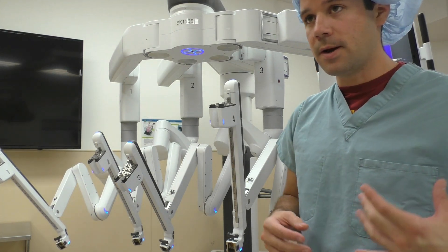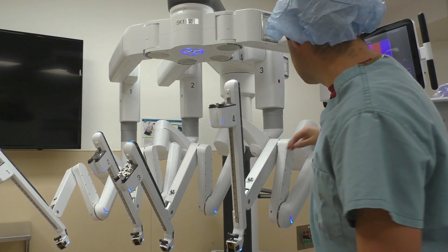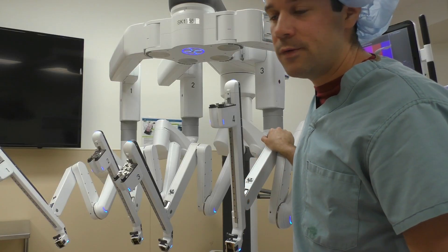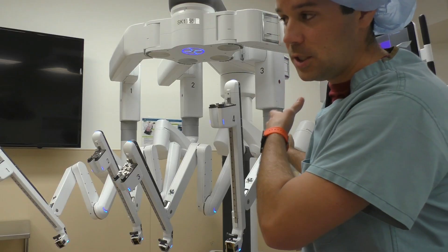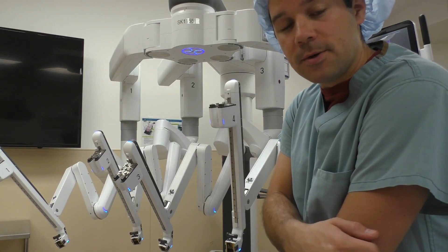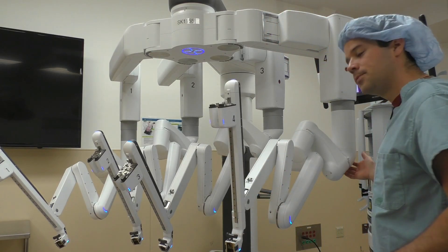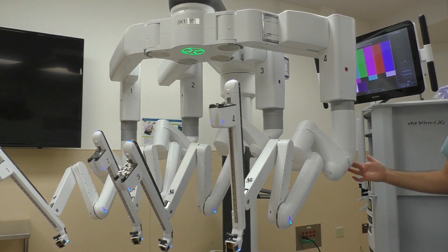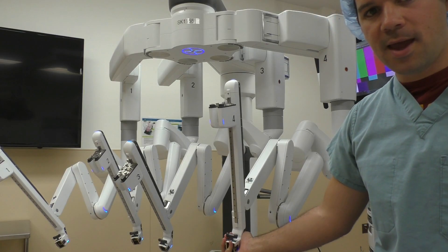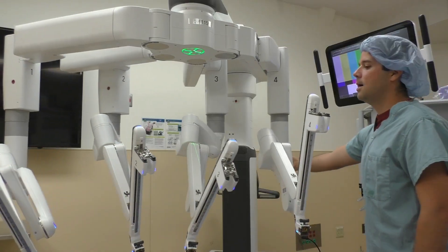First off, we're going to talk about how to move these arms specifically, and also how to move the boom from the field. Sometimes when the nurse is driving the robot in over the patient, you need to rotate the boom. She or he can do it from the back of the console, but sometimes it's just easier for the scrubbed-in people to rotate the boom as the nurse is pushing it in, getting ready to dock it. We have a button right here on the back of this arm — the shoulder, I like to call it — and if we hit this button and hold it down, we're able to rotate the entire boom itself.